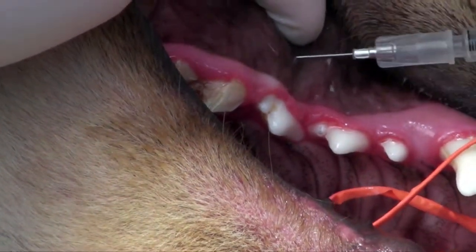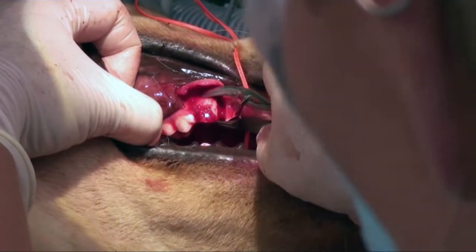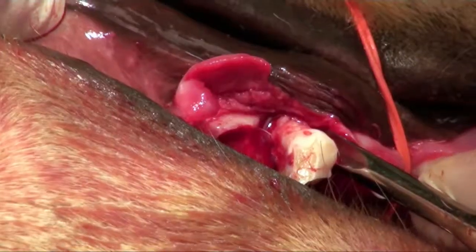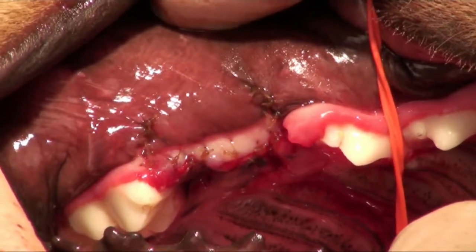painful for our patients. We're going to emphasize and spend the most time probably on performing oral surgery, from creation of a mucogingival flap to removal of buccal bone to sectioning the tooth to proper techniques to elevate and extract the tooth, release the periosteum and close the flap.